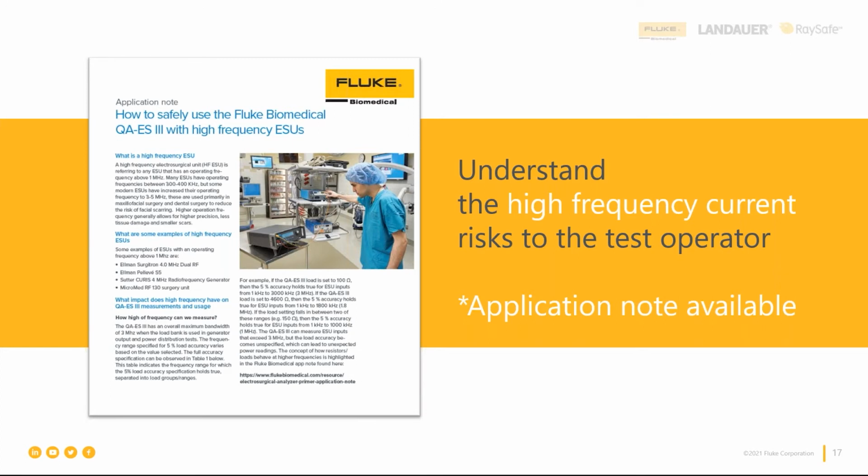And then one other thing before I let you jump in, Justin: test lead improvisation is... You stole it. Even more dangerous. Oh, I stole your thunder. It's even more dangerous here because you're dealing with high frequency current, and if you made something up, there can be some issues. And you have an example there, Justin? Do I have an example?